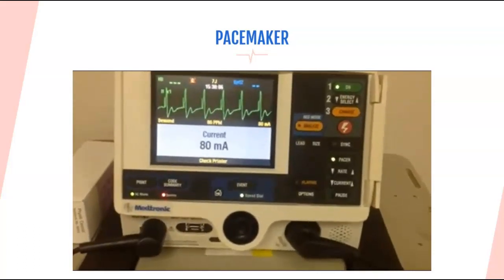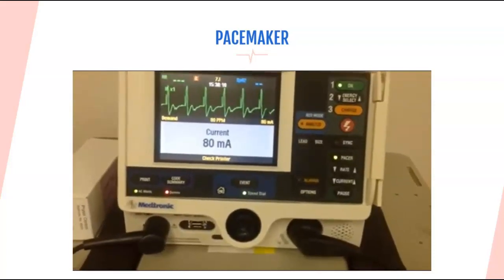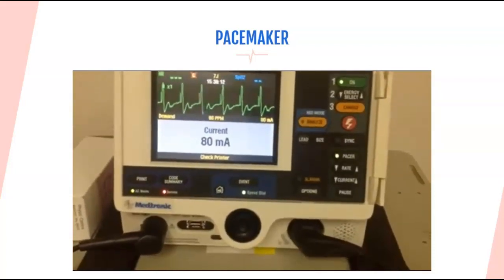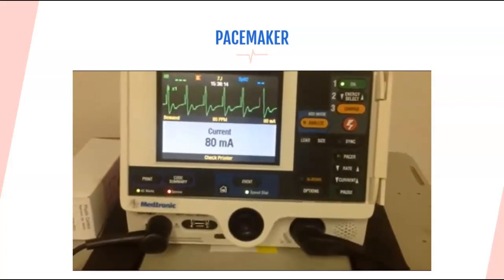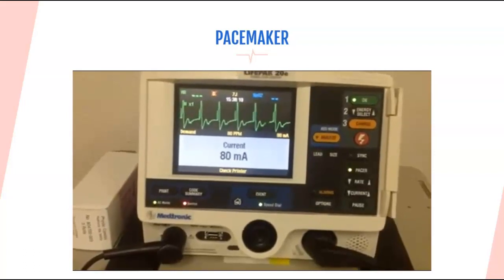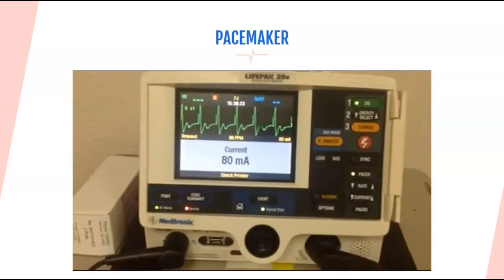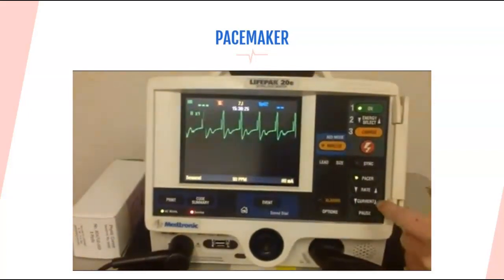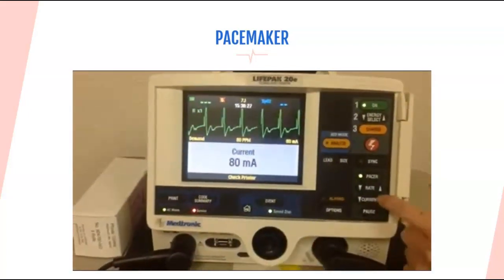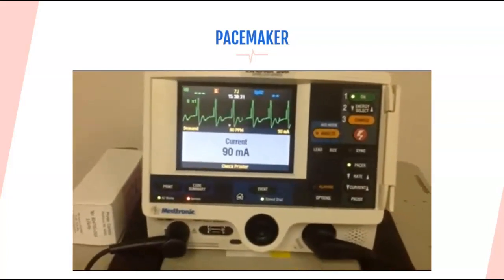Okay? Now, we would want to check to see if our patient had a pulse with that. And yes, they do have a pulse. We'd want to check in the femoral artery, not the carotid artery, because sometimes the muscle can spasm and lead you to misbelieve. So we're going to go up 10 more after we've reached capture. And there we are. We are pacing this patient.